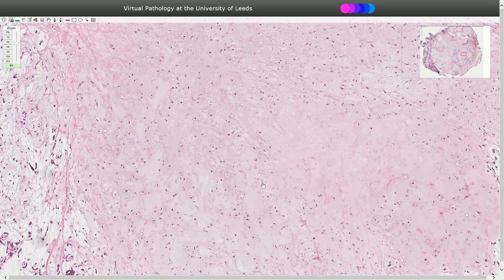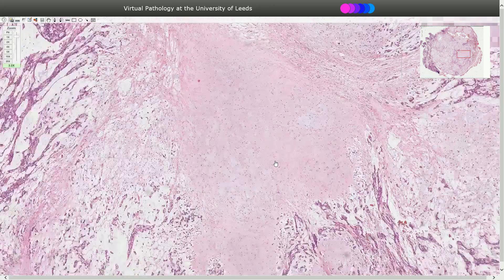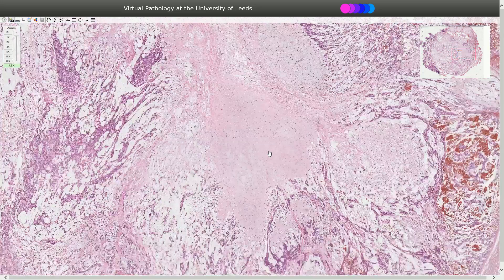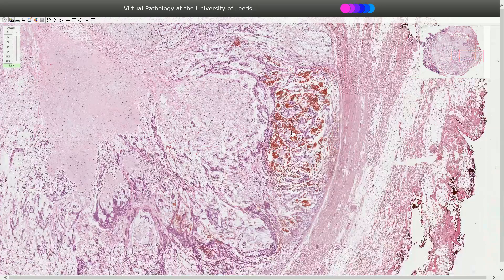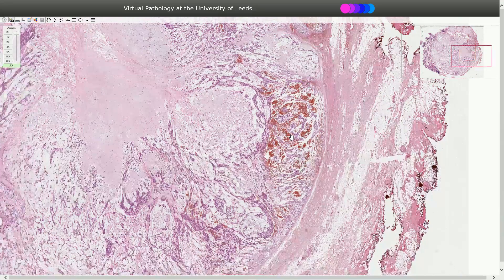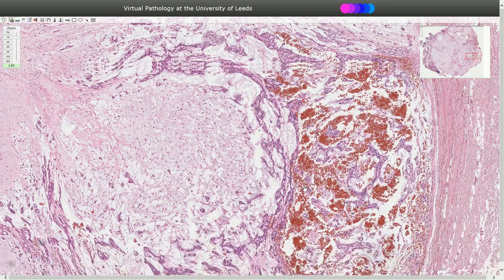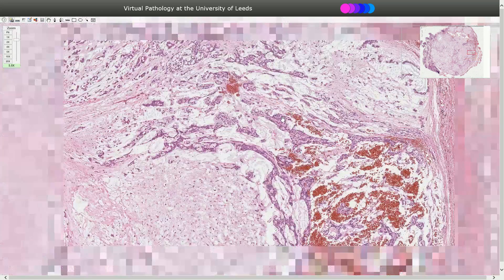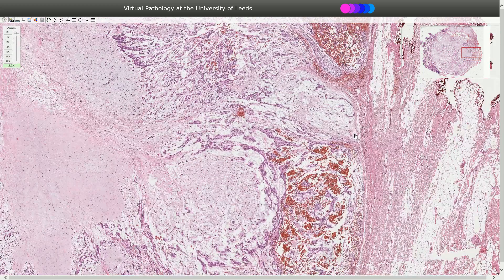Also here we see very common chondroid differentiation, so this stroma looks like cartilage — that's also very common. Sometimes we can see cystic differentiation; here we see some cysts with erythrocytes and hemorrhage. On the periphery we see the fibrous capsule, and there is no infiltration into the adjacent tissue.